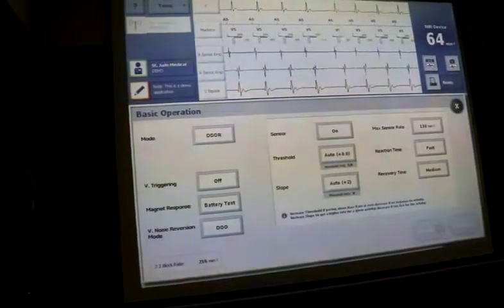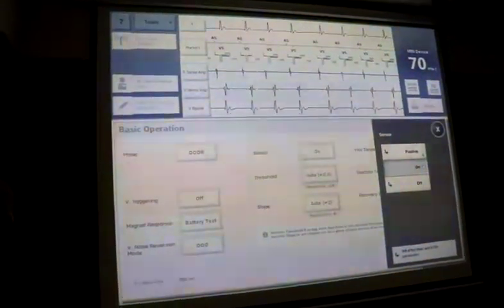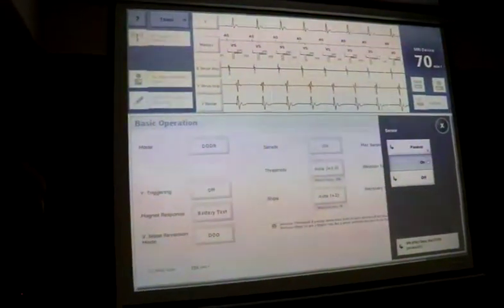Because it's much more physiological. Leave it alone. But yeah, they program it on everybody. We should not. Absolutely. And for patients with ischemia, rate response can push rates up, which can cause angina. Absolutely.